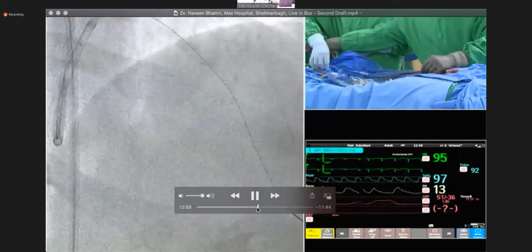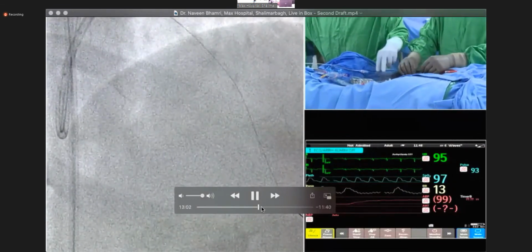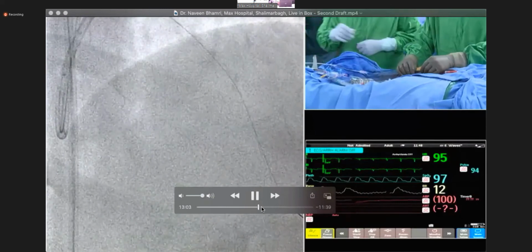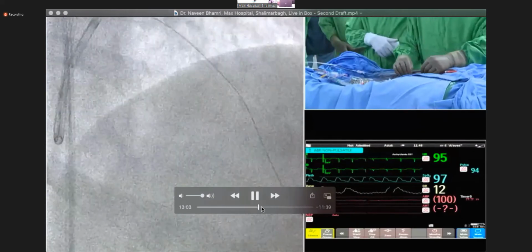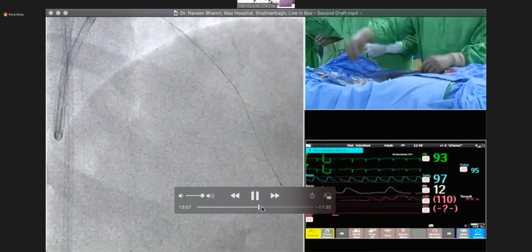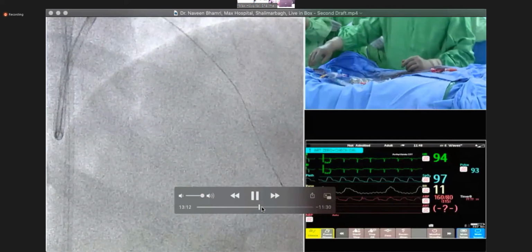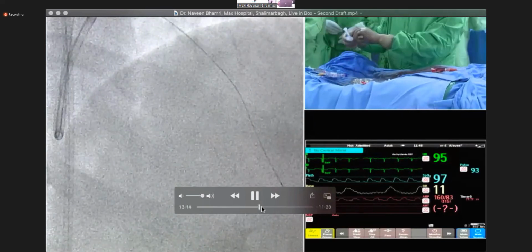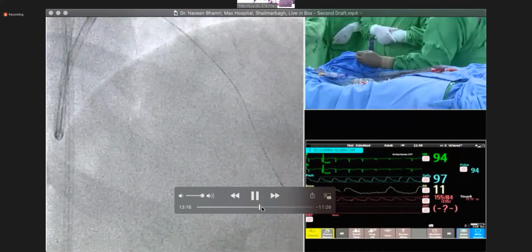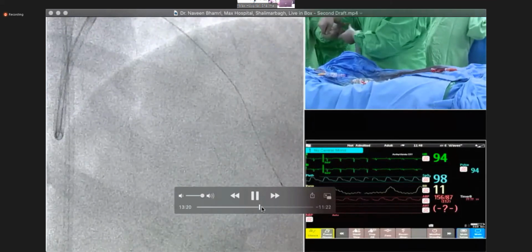Now we are out with the micro catheter, wire inside. Balloon deflate. Deflate the balloon. Balloon is out now. So now we are going to do imaging to look for the diameter of the vessel, length of the lesion, and we are going to see whether that calcium has broken or not.